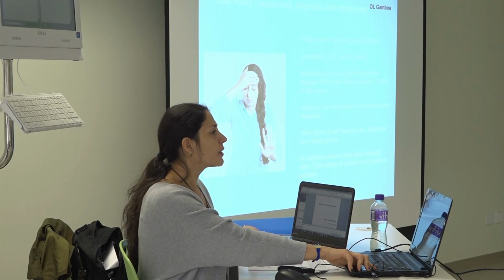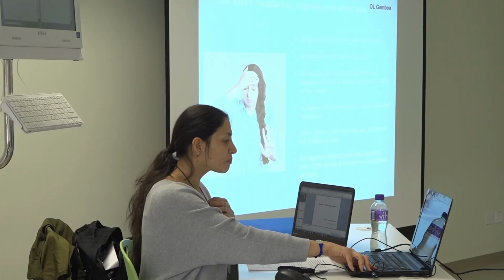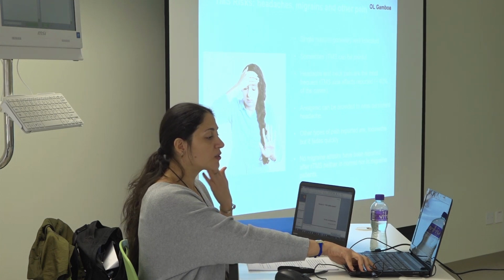But I wouldn't measure the person again if I know they have a headache or whatever. If the person reported something strange, I wouldn't measure the person again. I would prefer not to, but it's just my opinion. Other types of pain reported are toothache, but it goes quickly.